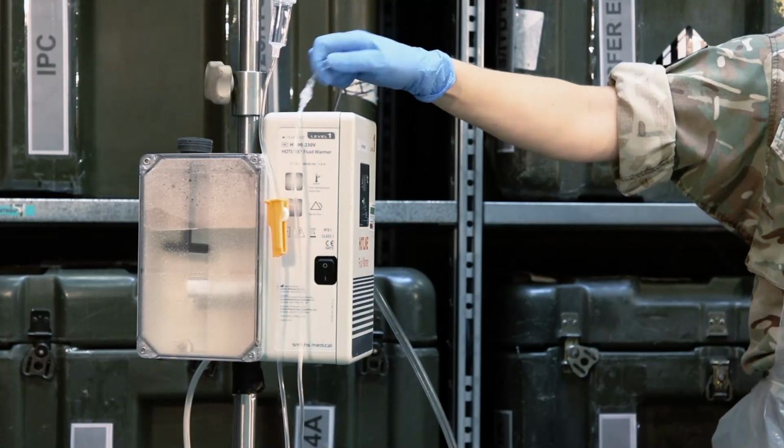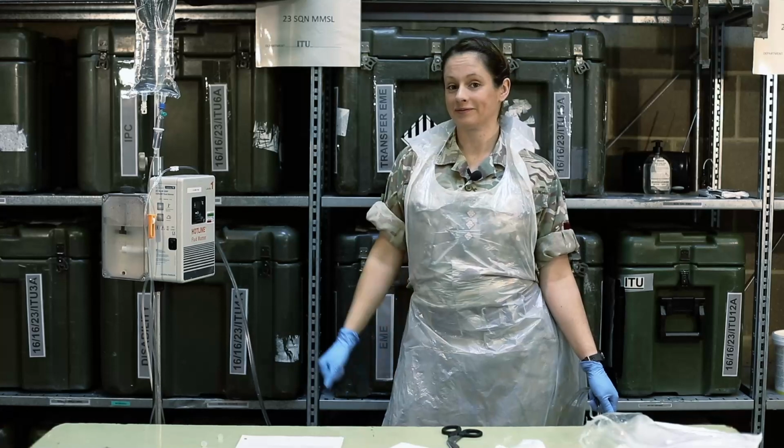unclamp the line, and warm fluid comes out. And that's it.